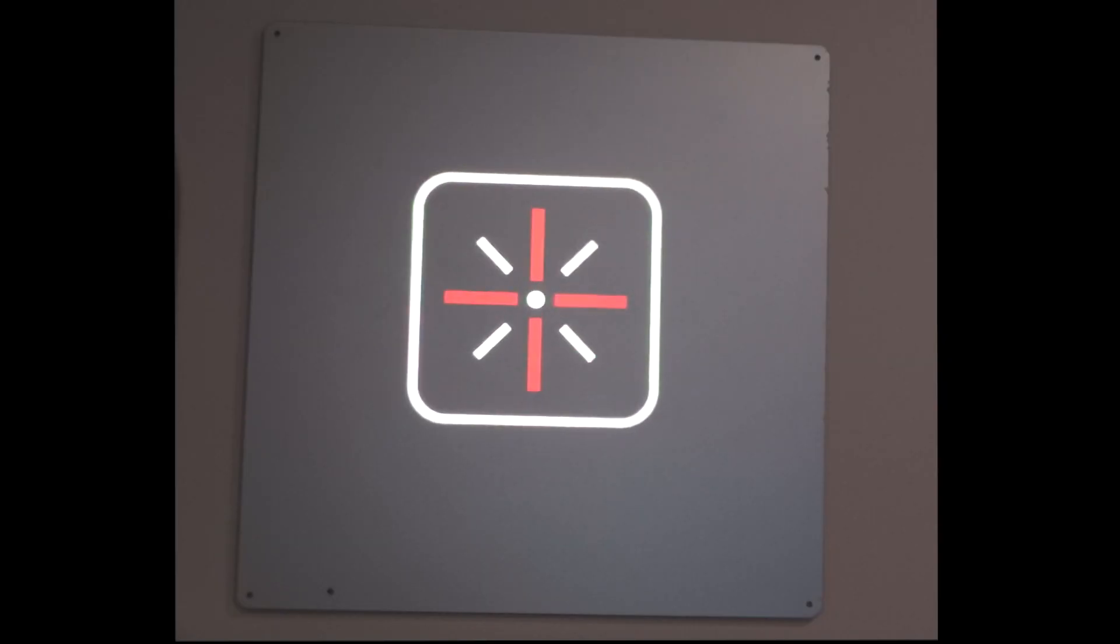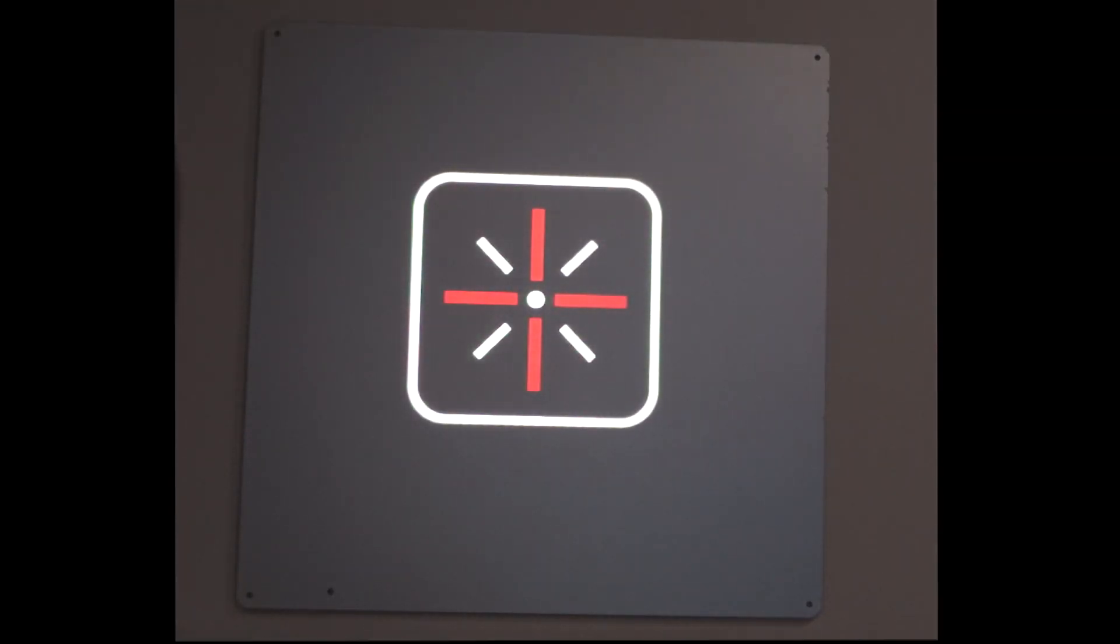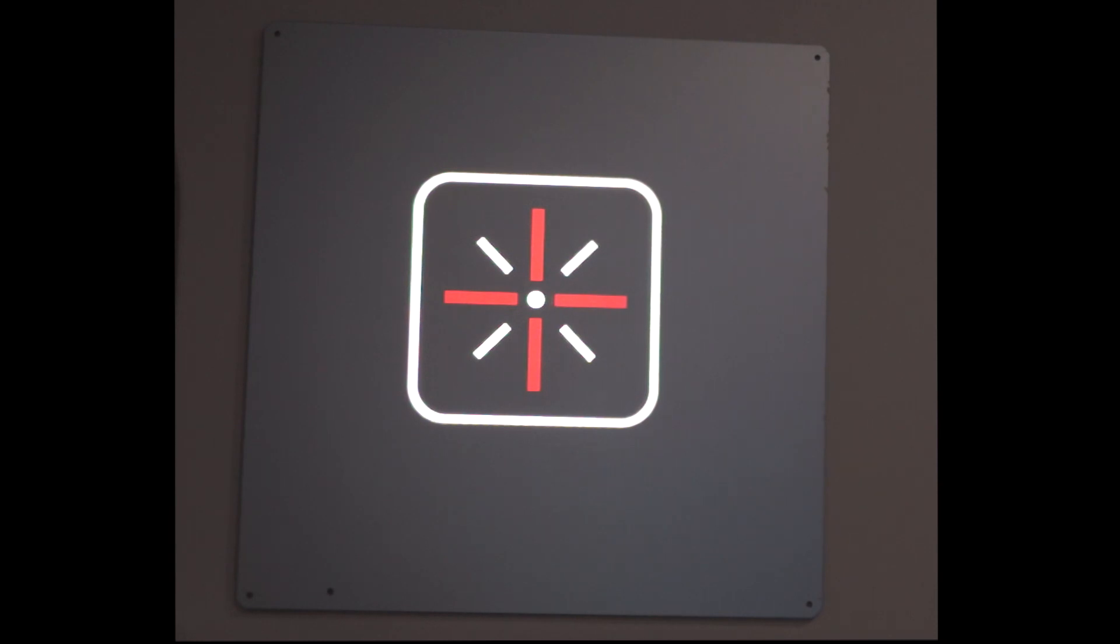The next thing we do is we show you this. It's called the fixation disparity test or distance fixation disparity. And the right eye, again, has a filter that only sees the 12 o'clock and the 3 o'clock red line. And the left eye only sees the 6 o'clock and the 9 o'clock red line. If you see all four, you know the brain's using both eyes. And if they form a cross, you know the brain's using both eyes and the alignment is perfect.